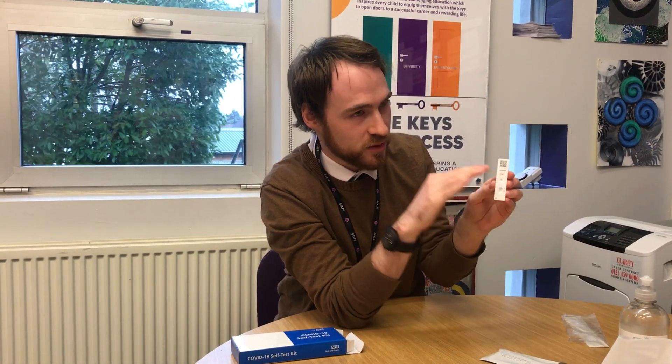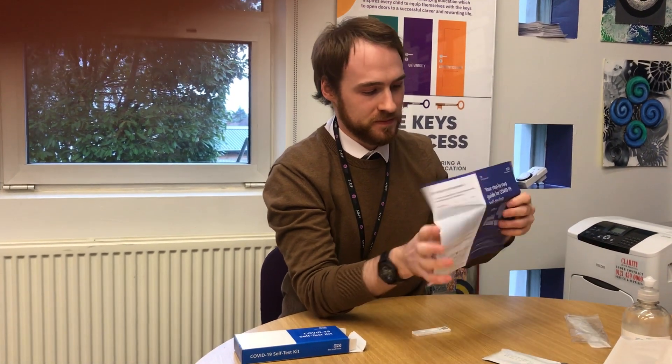When you return in half an hour you should see one of two things. Hopefully, next to the C insignia you should see one line — that of course means the test is negative. If you see two lines, one next to the C and one next to the T, that does mean the test is positive. Regardless of the result, it's very important that you take the following booklet and log the result on the government website, with instructions in the booklet for your convenience.